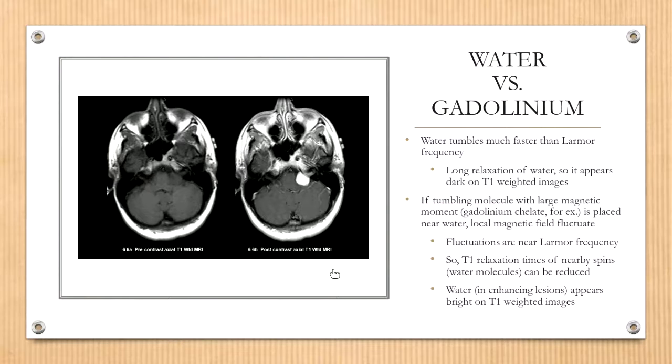As we can tell from these 2 images, on the pre-T1, we can still see that there's something going on because it is a pathology. And T1, even though it's technically used to visualize anatomy, will sometimes pick up on pathology if it's significant enough. Now, when we go to the T1 post, we've injected gadolinium. We're still running a T1, so our fat signal is still high and our water signal is technically low. However, because we've injected contrast, we will see that there is a stronger water signal from areas that typically would not have been showing on T1.